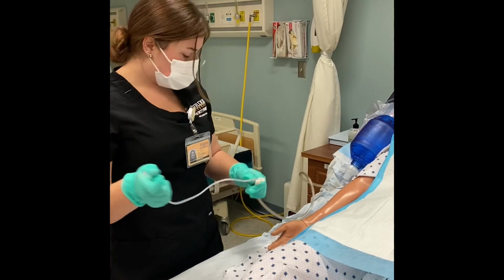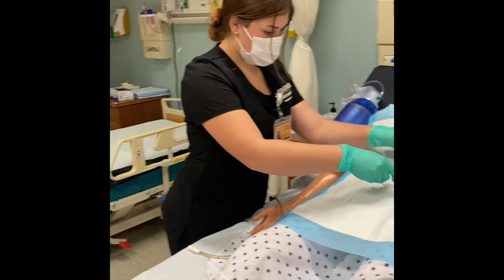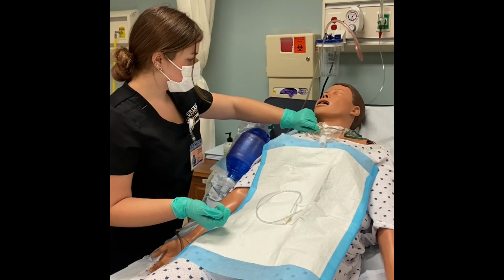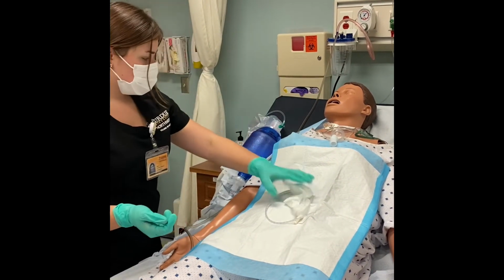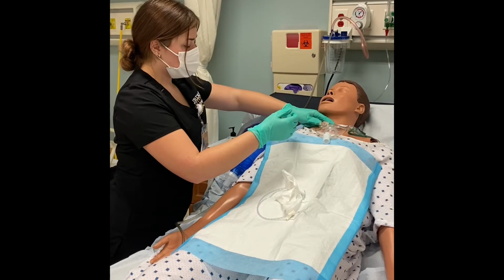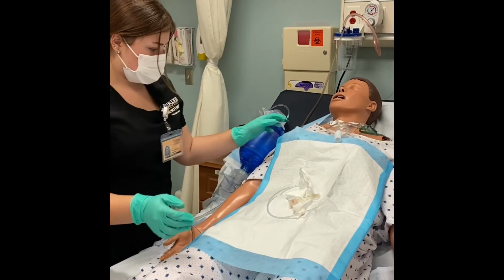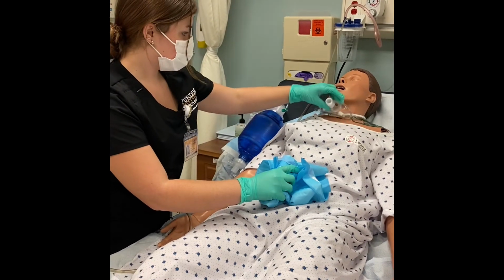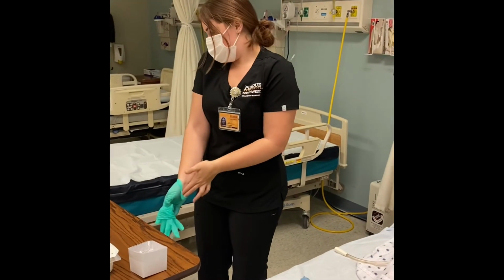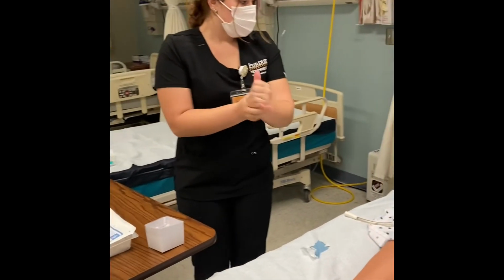So now I'm going to remove the catheter, place that in there, and then I'm also going to take my patient's dressing and remove that. I would also grab an assistant to hold the trach in place, if possible. So I would hold that in place with my non-dominant hand and remove that. And then I would discard, making sure that I place my patient back on their oxygen. I would discard all of that along with my sterile gloves, and perform hand hygiene.